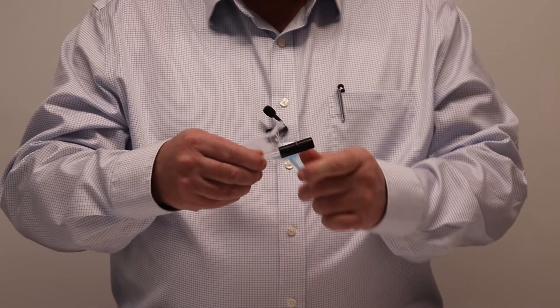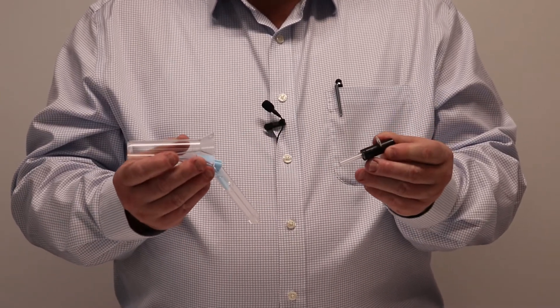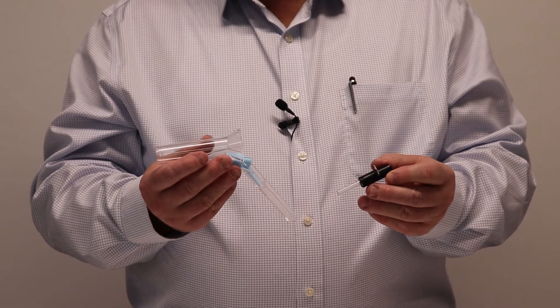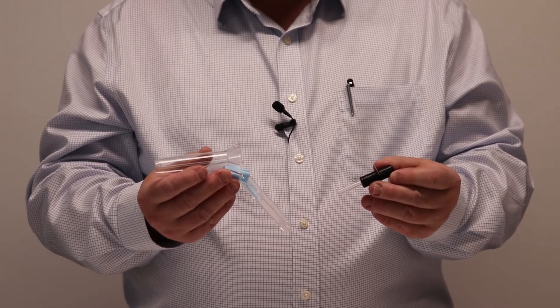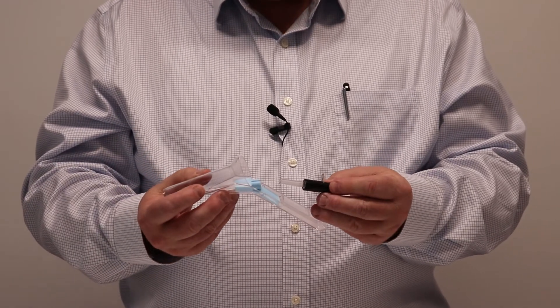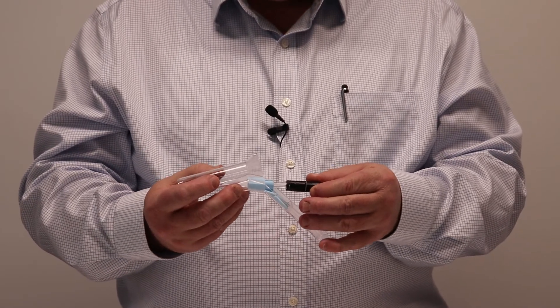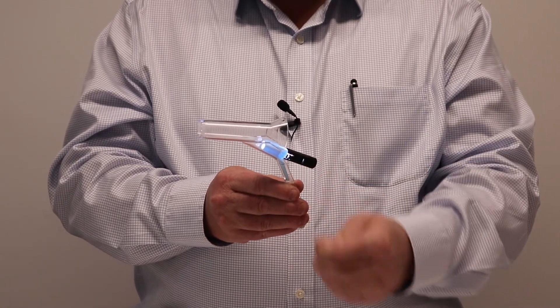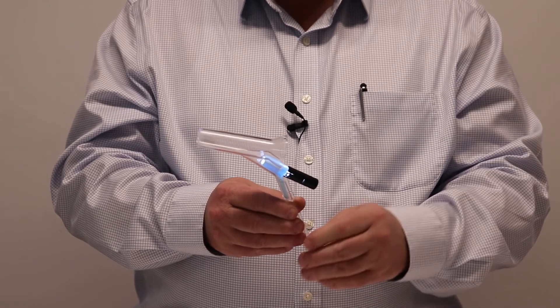Next we have the disposable LED. This is supplied with every examination and procedure proctoscope — you receive one of these per proctoscope. These insert into the light connector shown here.